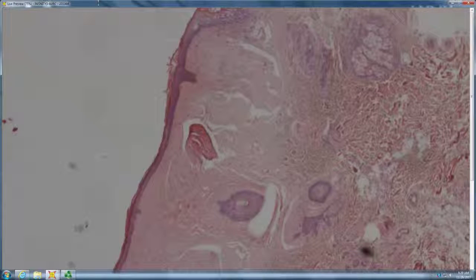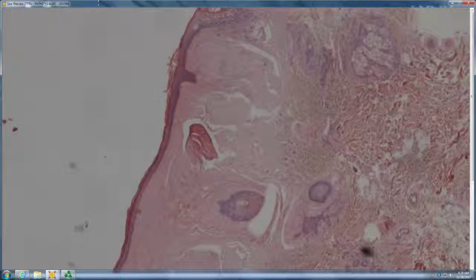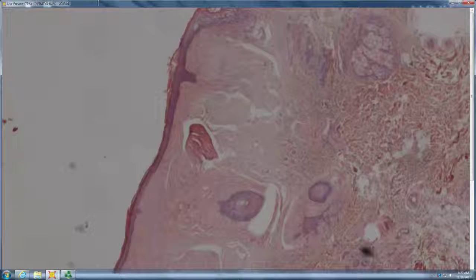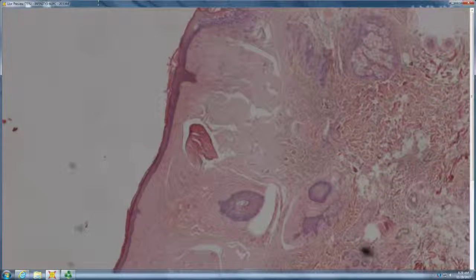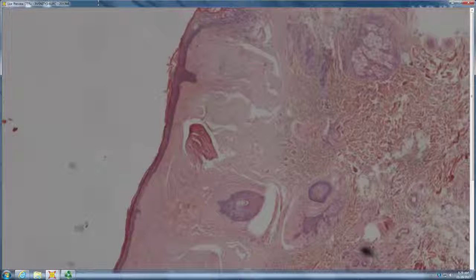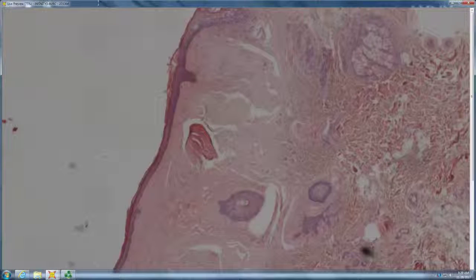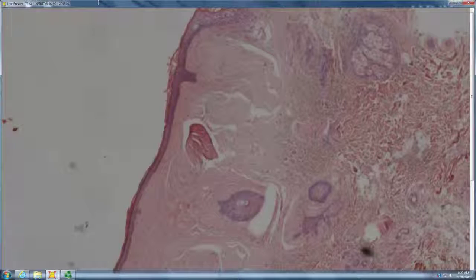This kind of has that vertical streaking. Vertical streaking. Hyaline lipoid protein. Yeah, so this is the hyaline material, vertical streaking around vessels, sometimes very prominent around eccrine ducts. And they talk like this because it gets into their vocal cords as well. And they have the string of pearls change on their eyelids. So that's all lipoid proteinosis. If that helps you remember it.